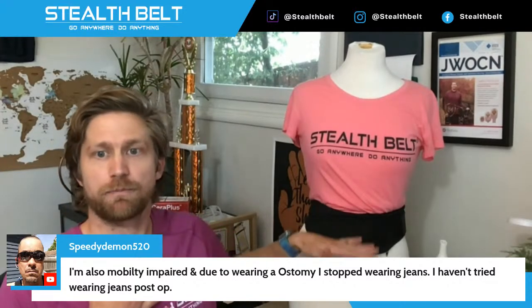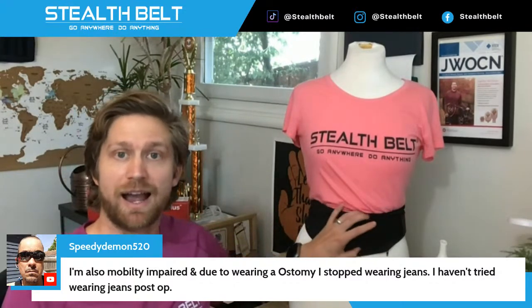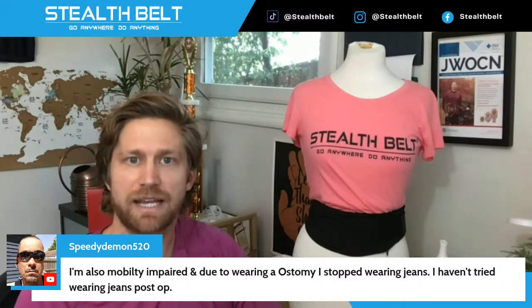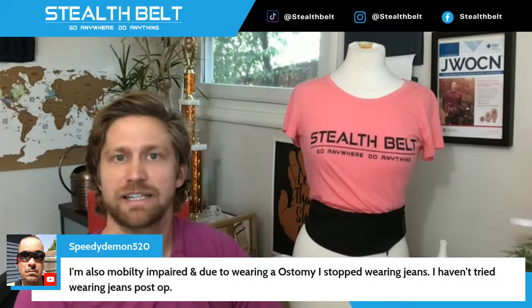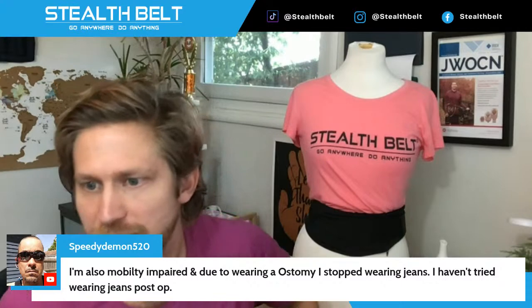If like me your pant line is below where the stoma is, I really like the horizontal wear for that reason — you're not having to tuck the bag into the pant line, which can cut off output flow and be generally more uncomfortable. Whatever the case, you shouldn't give up on your jeans. Do some testing and figure it out — I'm confident you can. If your stoma is above your belt line, the horizontal option might be the way to go.